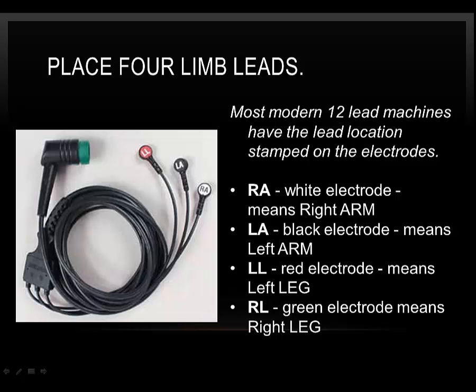The study gave 2 reasons the limb leads should go on the limbs: angle and amplitude. The angle that the limb leads see the heart from is altered with abdominal or thoracic limb lead placement. The amplitude is also skewed as the limb leads are augmented to make them bigger since they are on the limbs. Taking the limb leads off the limbs can lead to over-augmentation. This can lead to false positives, meaning exaggerated ST segments and size of the ECG, making the 12-lead non-diagnostic.